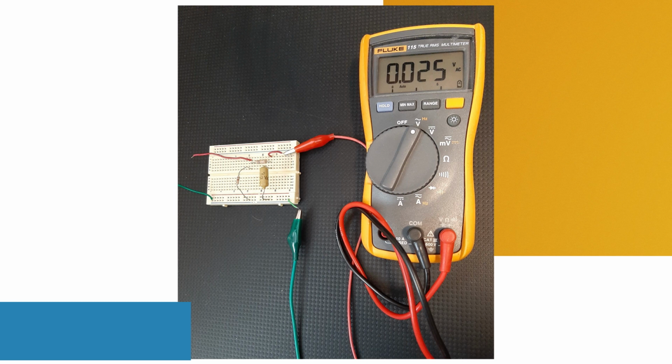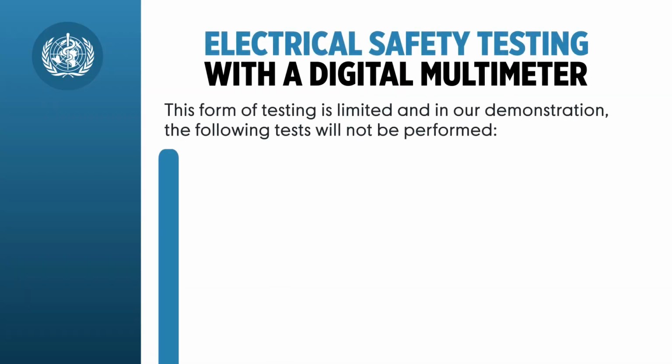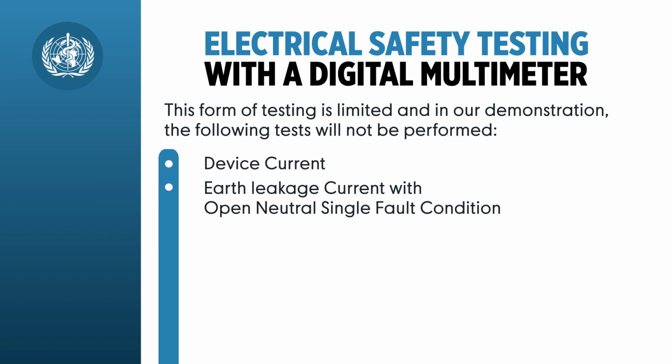Extra precautions should be taken when using this method of electrical safety testing. Any modifications to the connectors must be done carefully, as they create electrical shock hazards. This form of testing is limited, and in our demonstration, the following tests will not be performed: device current, earth leakage current with open neutral single fault condition, mains on applied parts, and insulation test. Nonetheless, if you do not have access to an electrical safety analyzer, this form of testing is valuable in ensuring electrical safety.